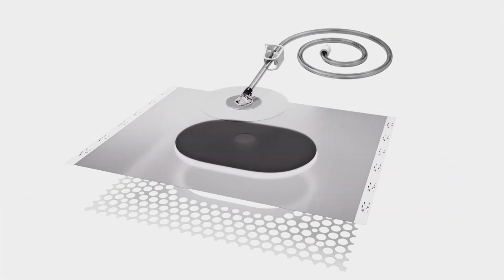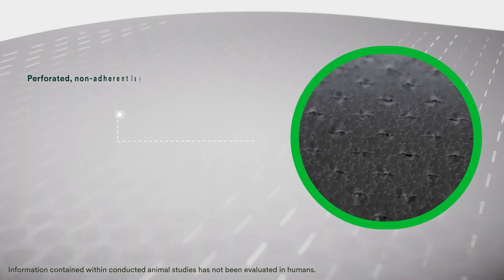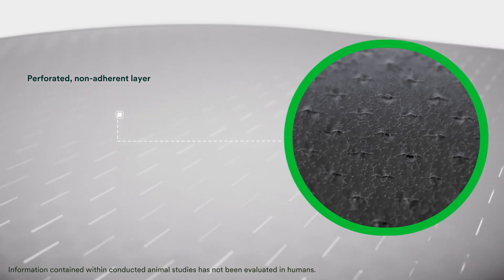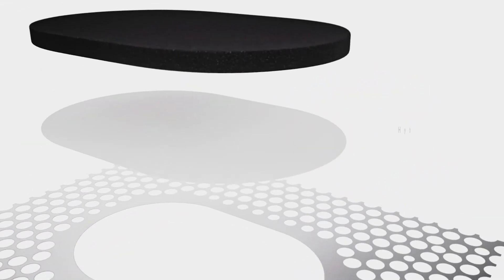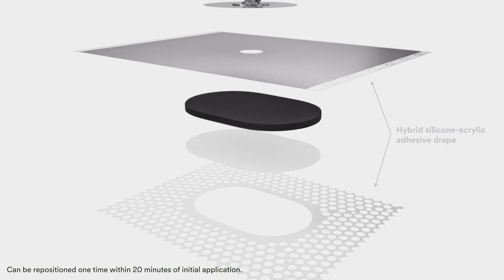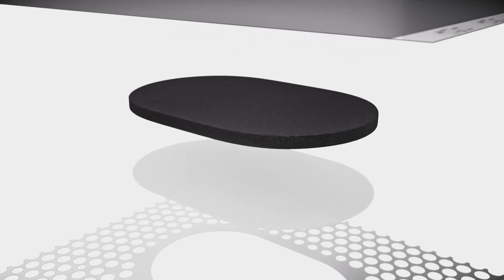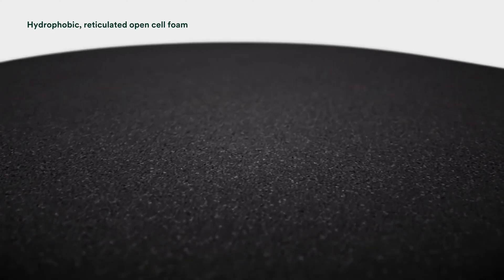The integrated dressing includes several unique components. The perforated, non-adherent layer reduces the risk of tissue ingrowth, foam adhesion to the wound bed, and disruption of the wound bed during dressing changes. The hybrid silicone acrylic adhesive drape portion surrounds the non-adherent layer. The dressing is repositionable for 20 minutes after initial placement and provides an effective seal on most anatomical locations. The middle layer is a thin layer of hydrophobic, reticulated open-cell foam.